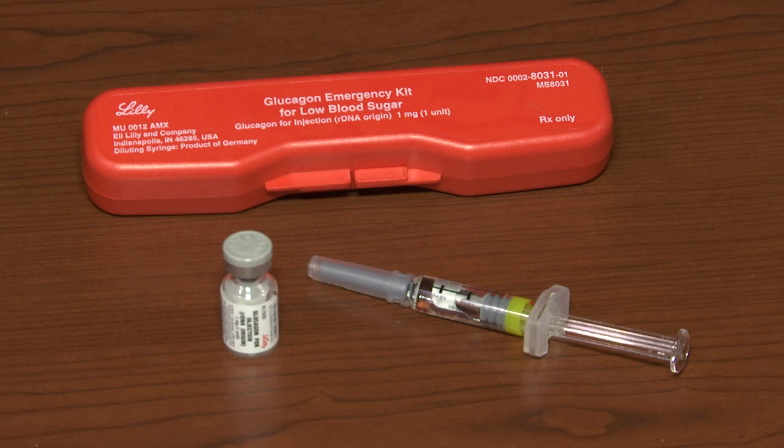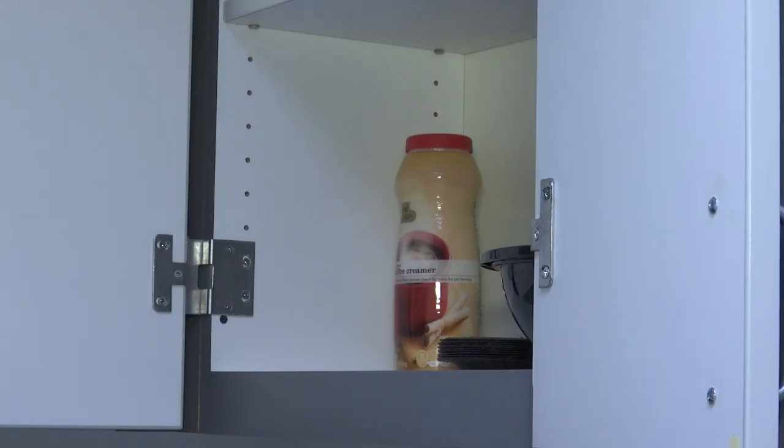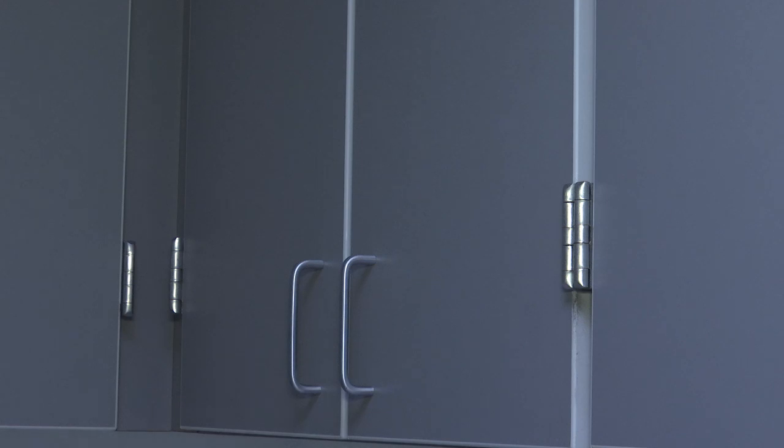The Glucagon kit contains a vial of sterile Glucagon powder, an attached needle, and a syringe containing a sterile diluting agent. Be sure to always have an up-to-date Glucagon kit available and someone trained to administer it. Your kit should always be stored at room temperature and only used when you are unable to swallow or when you are unconscious.